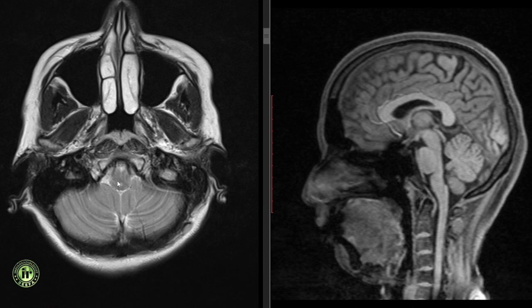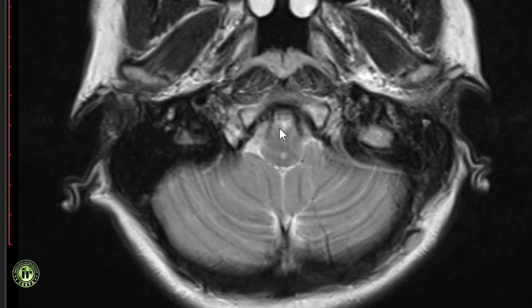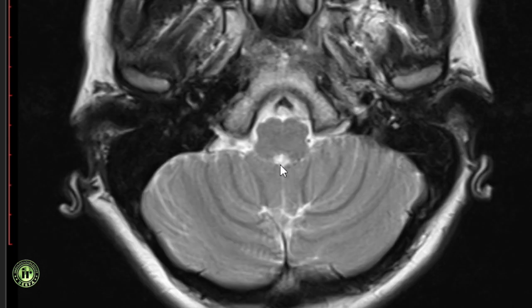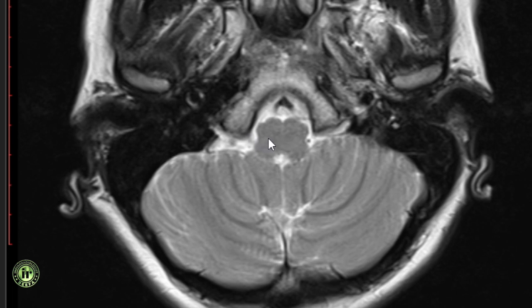The medulla is closed inferiorly around the central canal, extending from the level of the foramen magnum to the obex. The closed medulla appears pear-shaped on axial imaging. The anterior eminences are formed by the pyramids and the posterior columns form the posterior eminences. At the level of the foramen of Magendie, the medulla appears square-shaped. Between the ventral median fissure and the anterolateral sulcus is an elevation called the pyramid. Lateral to this is another elevation called the olive. On the lateral surface, there is an indentation corresponding to the post-olivary sulcus. On the dorsal surface, we can identify the dorsal median sulcus.